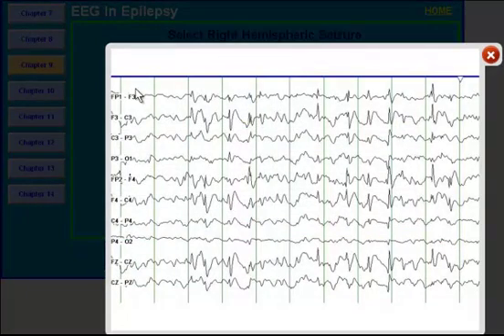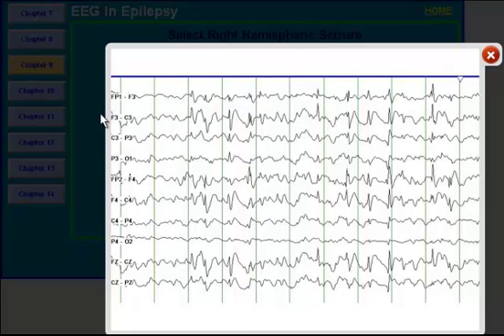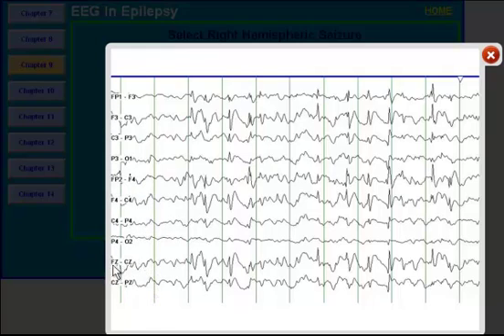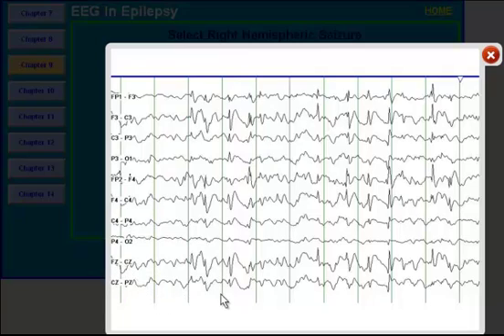The odd numbers record electrical activity from the left side of the brain, the even numbers record electrical activity from the right side of the brain, and FZ, CZ and PZ record electrical activity from the midline. These dark green lines are separated by one second.